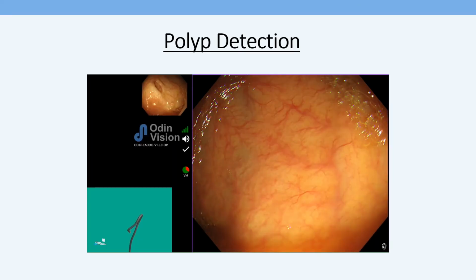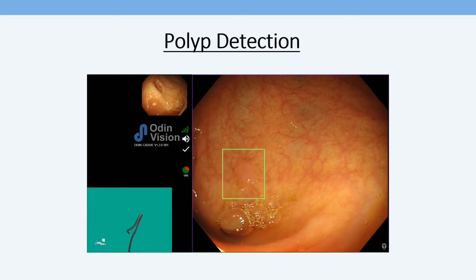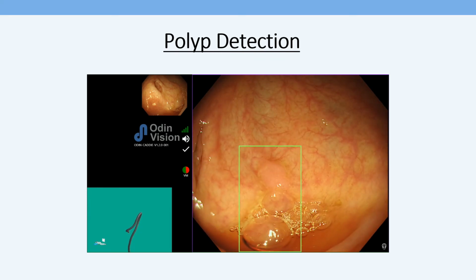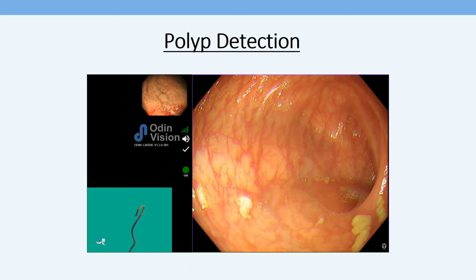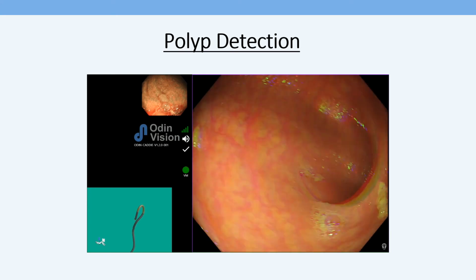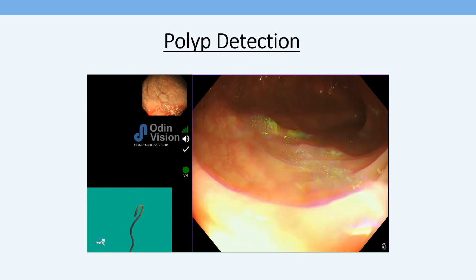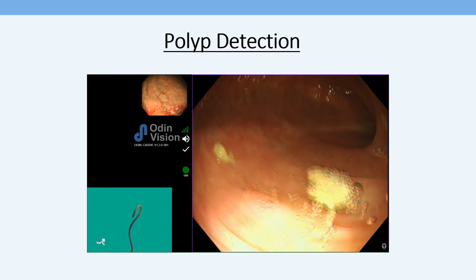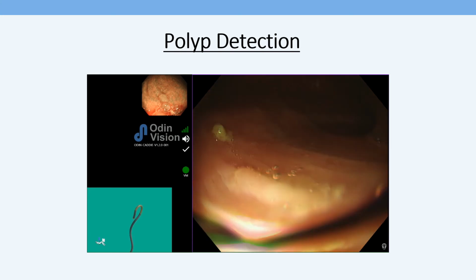Again, this is one of our in-house systems. We're currently running the CADDY trial. So you can see the colonoscopy configuration on the bottom left, and then you can see how in real time we're getting input of the mucosa, data processing against the algorithm, and then it moves on to a more augmented decision-making tool as an output shown in a green box.